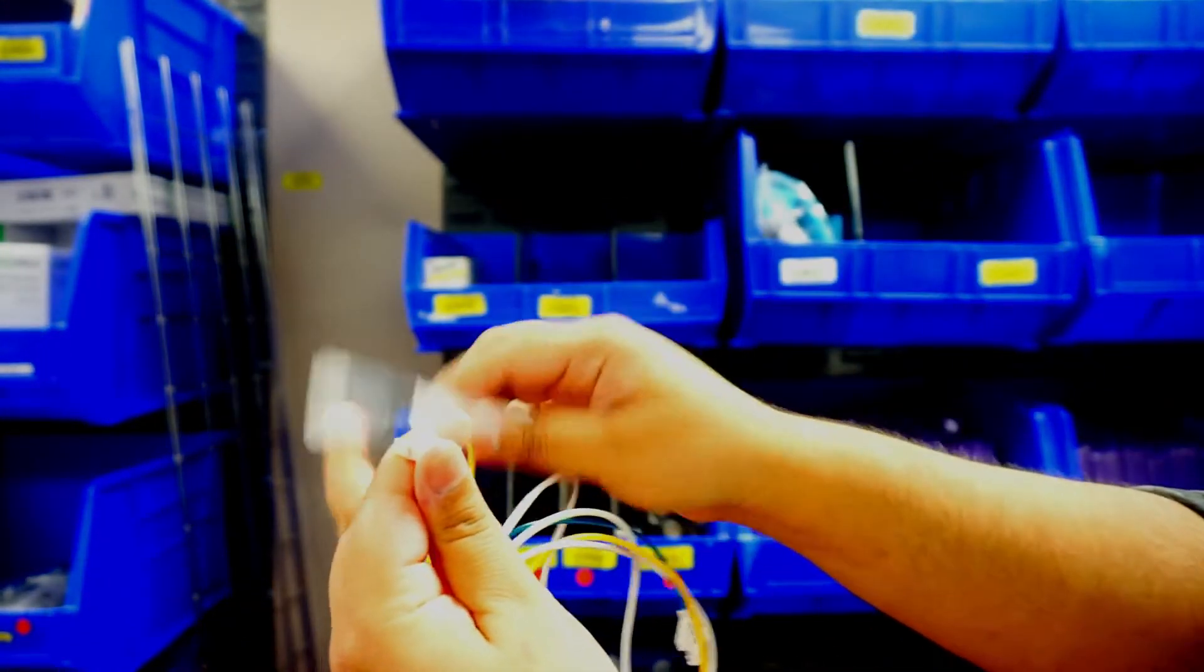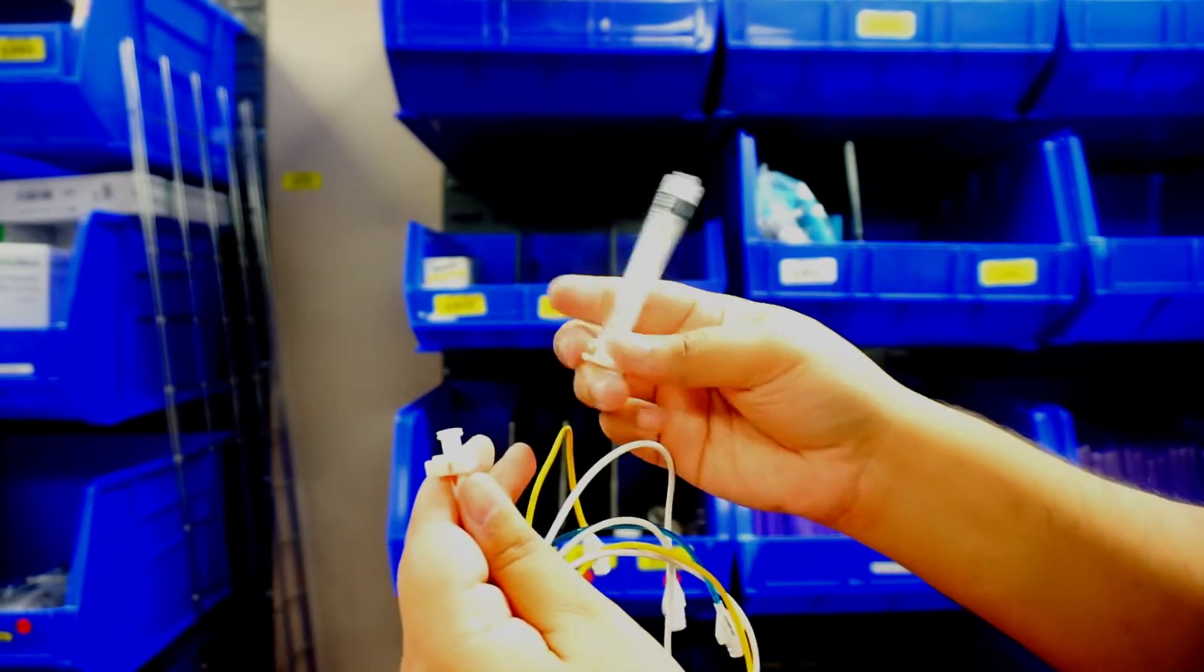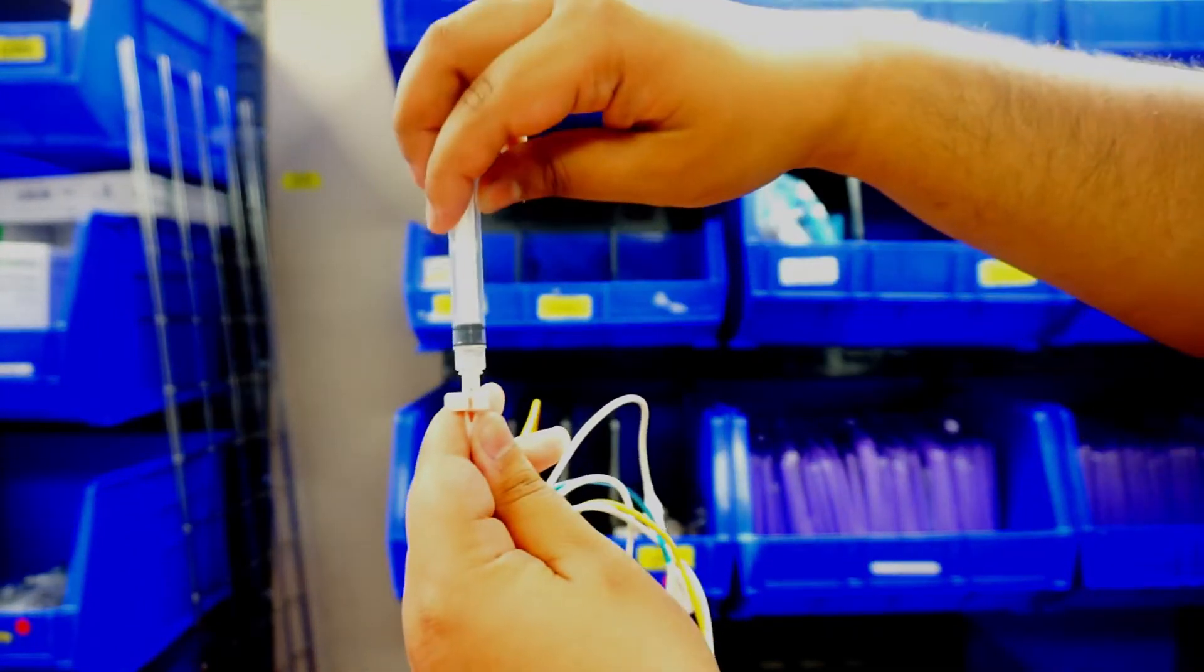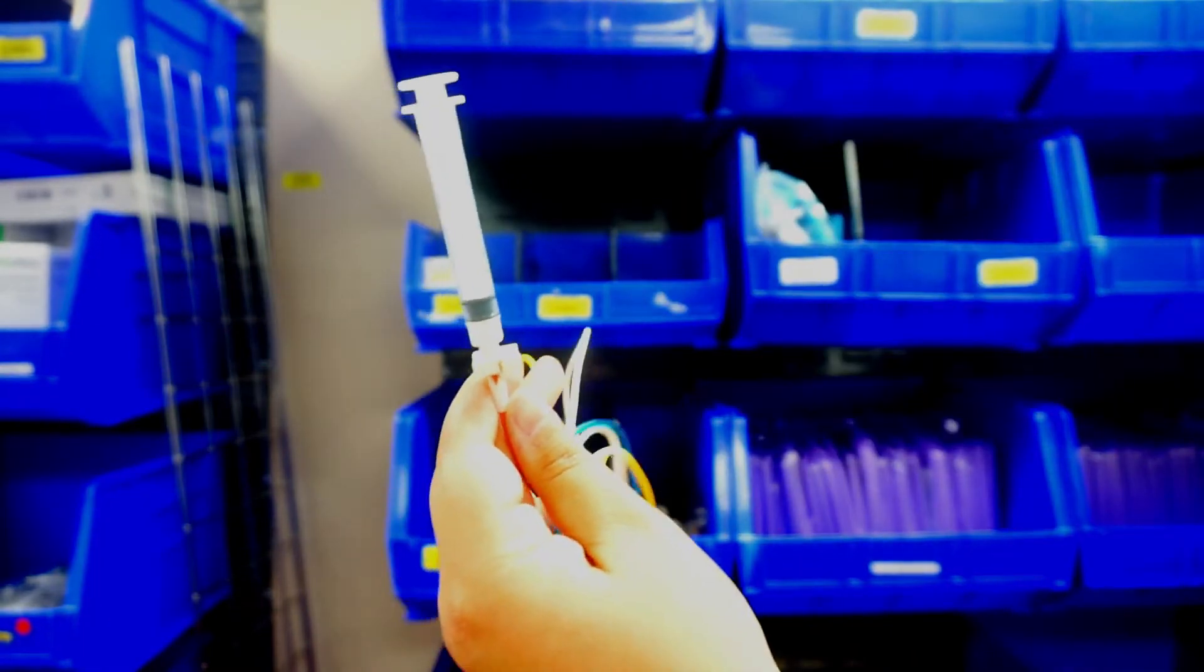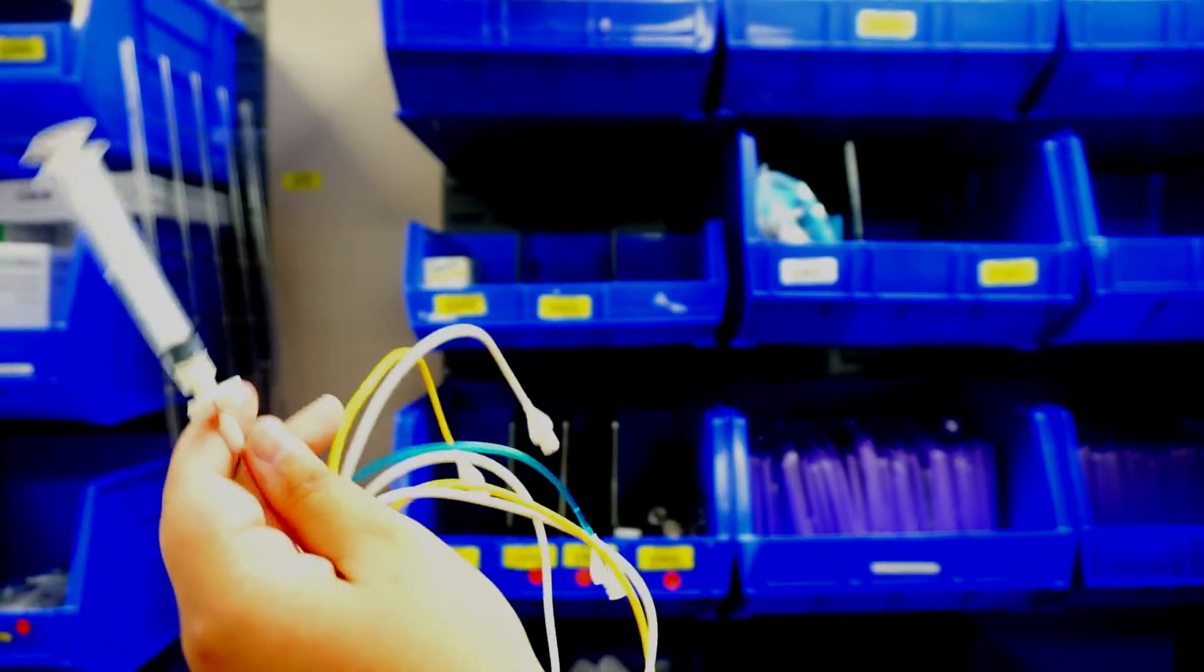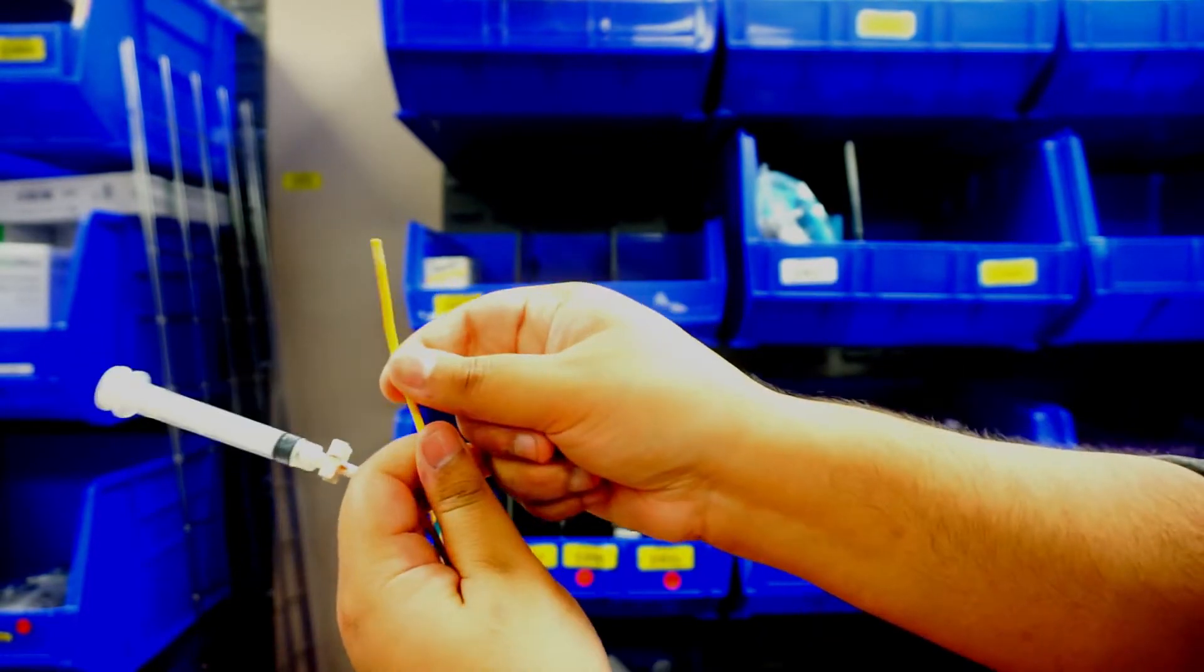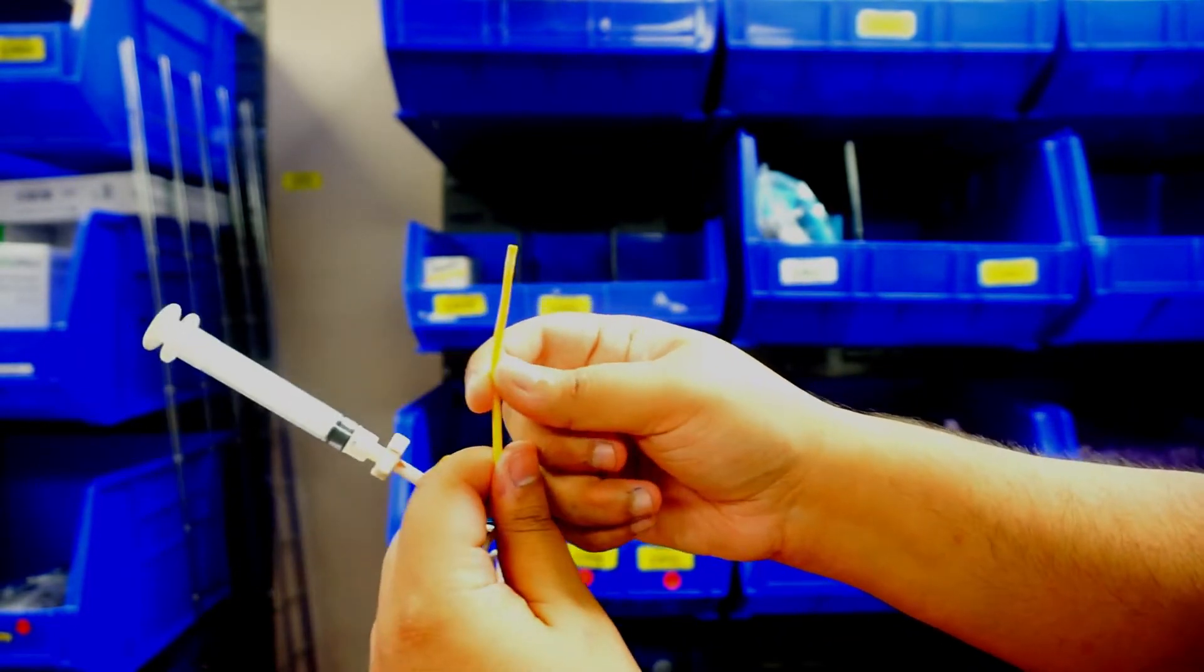we're going to undo, let any air that's in there escape. We're going to empty our syringe. I'm going to put this back on and I'm going to lock it. So the end of the balloon, the end of the line, the balloon is not going to be inflated.